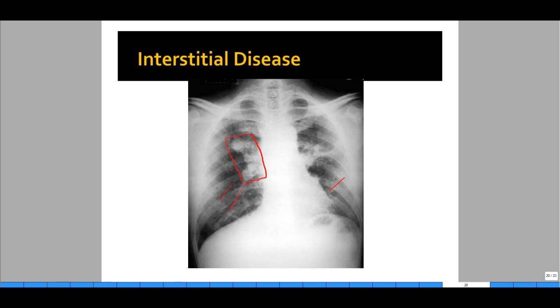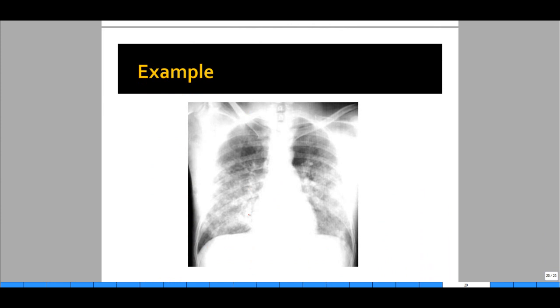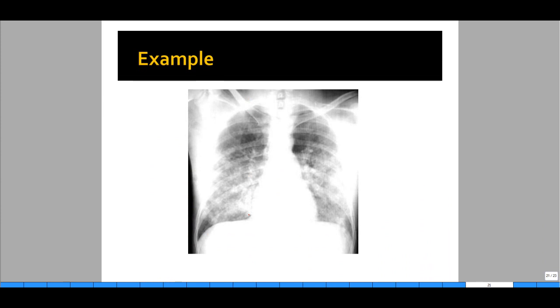Let's go to our first practice chest x-ray. Take a minute, pause, and look at this chest x-ray. There is diffuse haziness bilaterally with no focal findings — this indicates pulmonary edema. It's important to identify this in any hospitalized patient. If a patient is short of breath, you can consider Lasix to diurese them, but always figure out why they're having pulmonary edema. This is a CHF exacerbation from too much fluid.